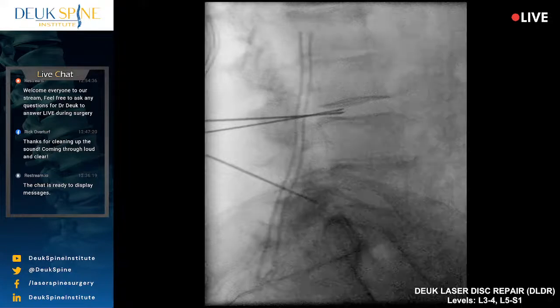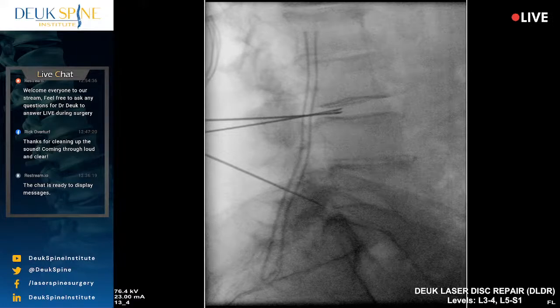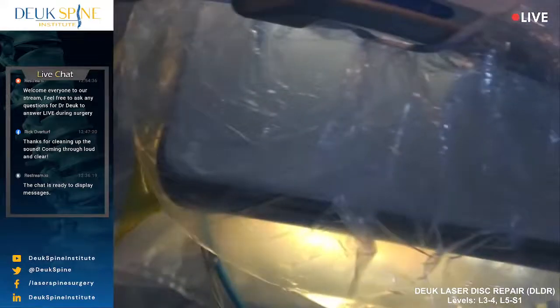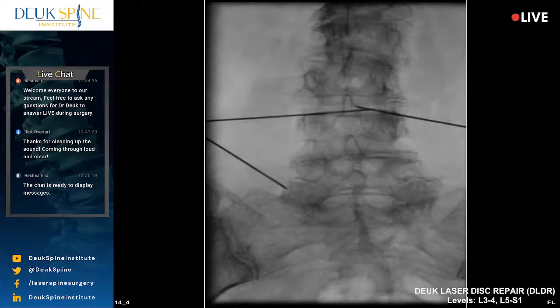Where do you feel that? In the back? Yeah. All right. Back is okay. Shot. We're right where that bad disc is. Let's do an AP again. That's why it's uncomfortable. It's full of arthritis. It's not bad. Let's go back to a lateral. Thank you, Luis.